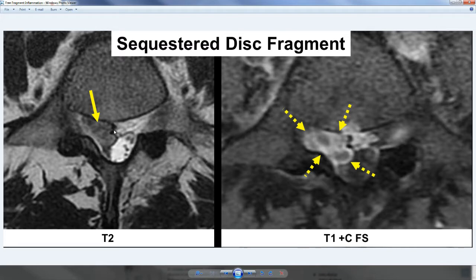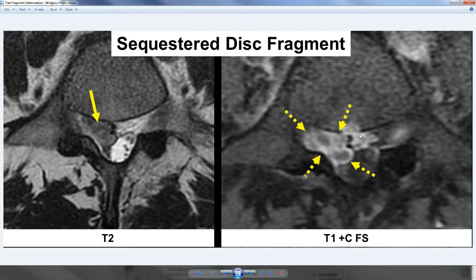On the T2 image, the disc herniation looks like a big broad gray structure sitting on the right side. But when you add gadolinium — a contrast agent that helps show inflammatory tissue as bright white — what you can see is that the disc fragments themselves are two pretty small pieces surrounded by all this white inflammatory fluid that even crosses the midline. This MRI scan shows that the disc herniation is much bigger than it appears, but the fragments themselves are actually pretty small.